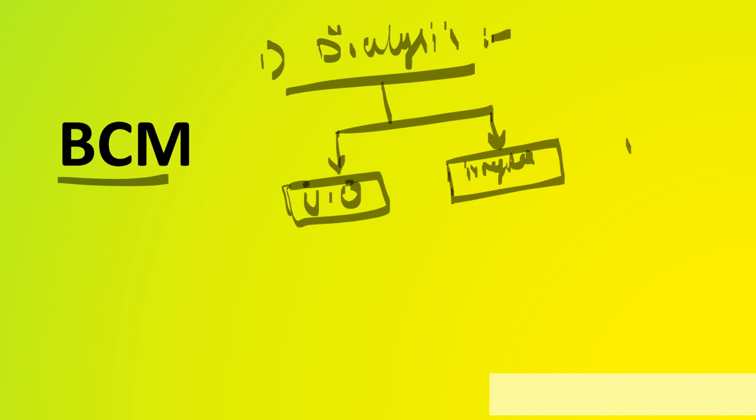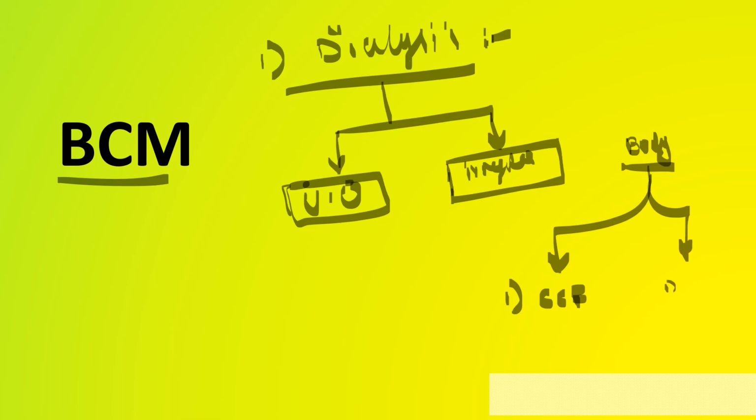If the body water content is not maintained correctly, and it is on the higher side, there is a chance the patient will go into volume overload, cardiac failure, these kinds of problems. If the body water is not adequate, the urine output might further decrease, and there will be subsequent health issues because of the decreased residual urine output. Not only that, they are at highest risk of malnutrition, so you have to keep the nutrition also high.